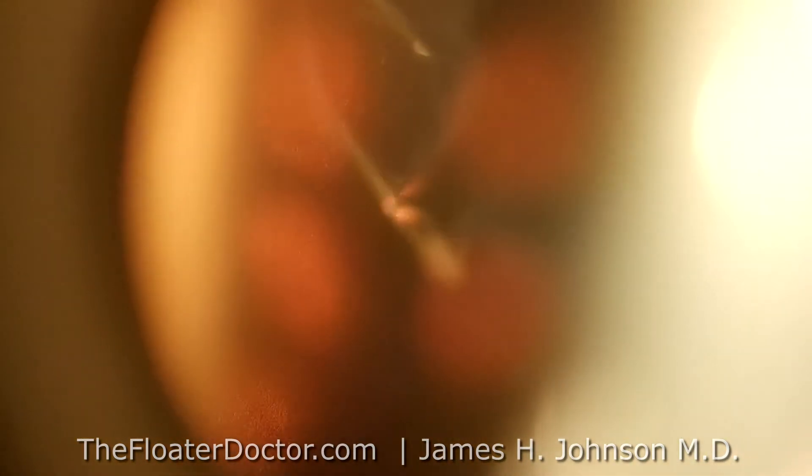This is David and we're looking into David's left eye. Opening this up, we have a nice big pupil here, and as I move my focus a little further back we should see our floater come into view — right there. With your right eye, follow that light. To the patient, this would look like a very large, relatively large, dense spot moving around in the vision.